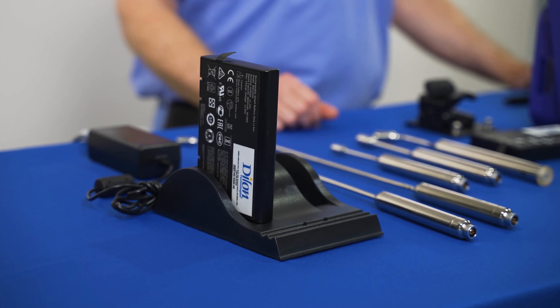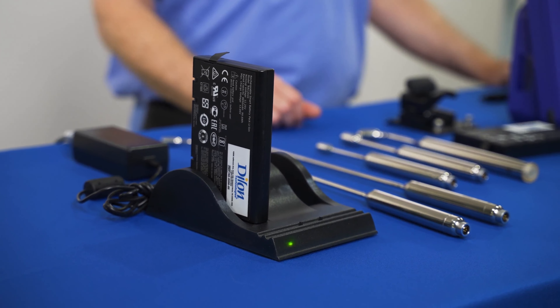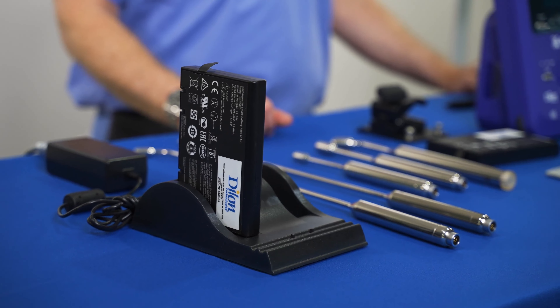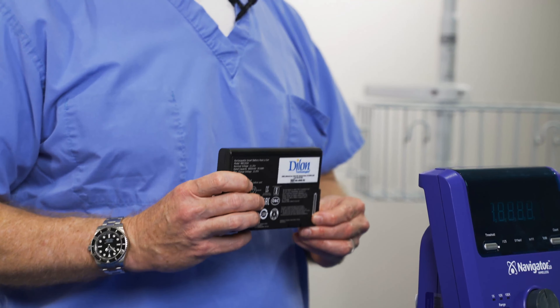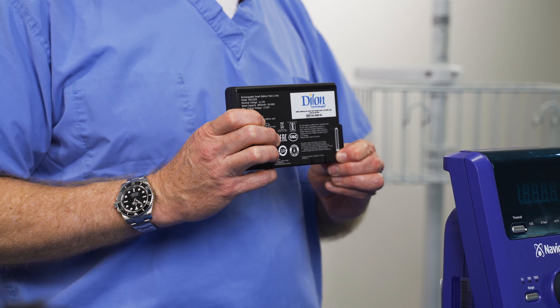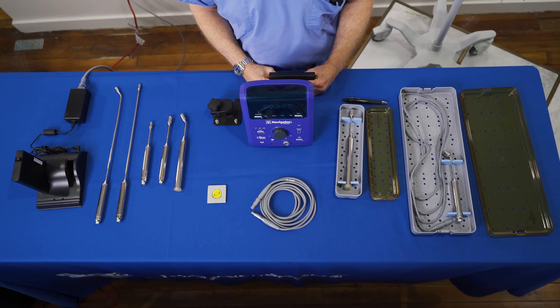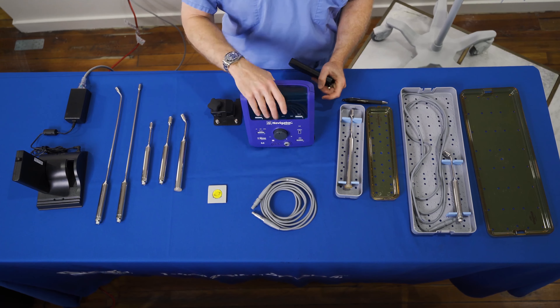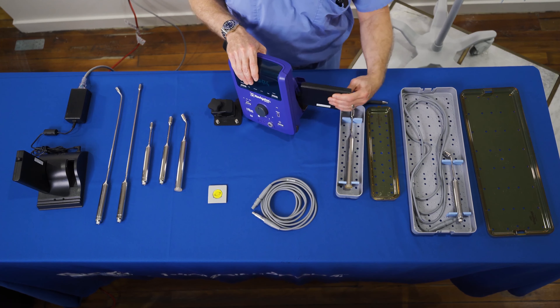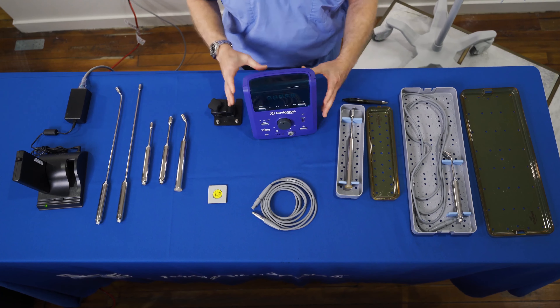There is an indicator light on the charger to let you know the status of the charge. Flashing green means charging; solid green means fully charged and ready to unplug. You can quickly check the battery charge level on the actual battery by pressing this button — four lines show the battery is fully charged. To insert the battery into the control unit, open the battery box door and insert the battery face up. Close the latch securely, ensuring that it is fully latched.